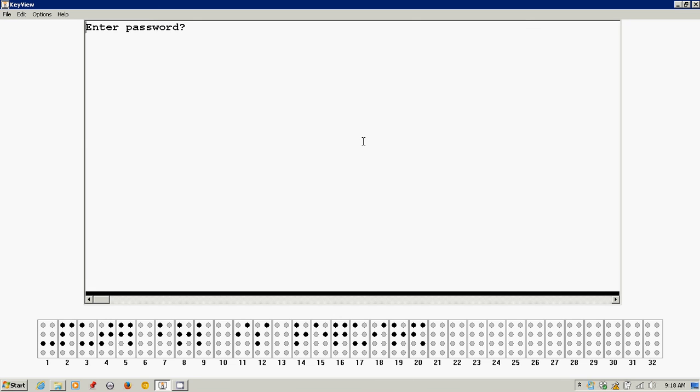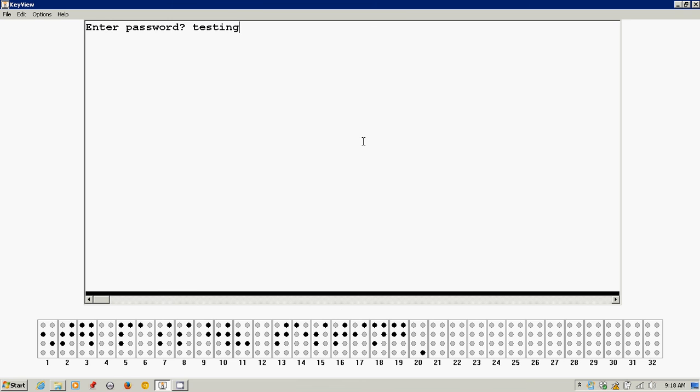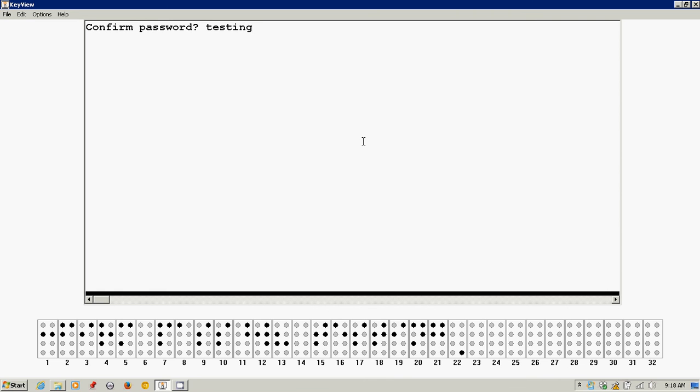Enter password. So now we need to use just regular grade one braille. So I'm going to type in just the word testing for my password, T-E-S-T-I-N-G. And I'll press enter. Confirm password. So I need to type it a second time, T-E-S-T-I-N-G. Enter. Confirm changes. And now it's saying, are you sure you want to do this? So it's saying confirm changes. I'll press Y for yes.